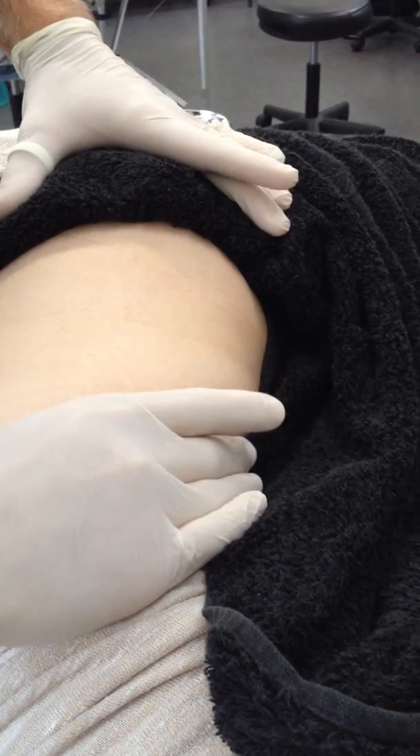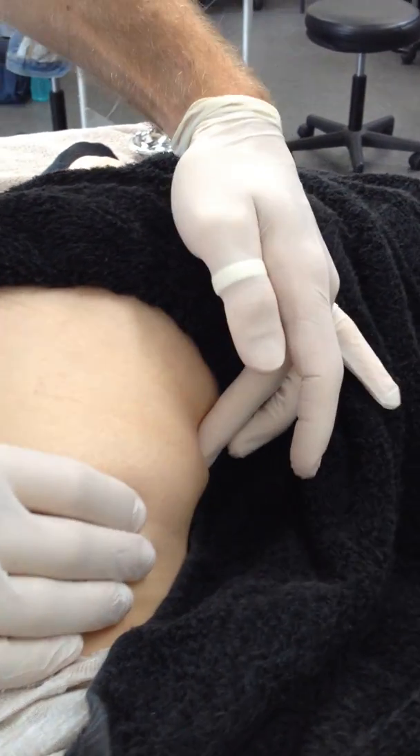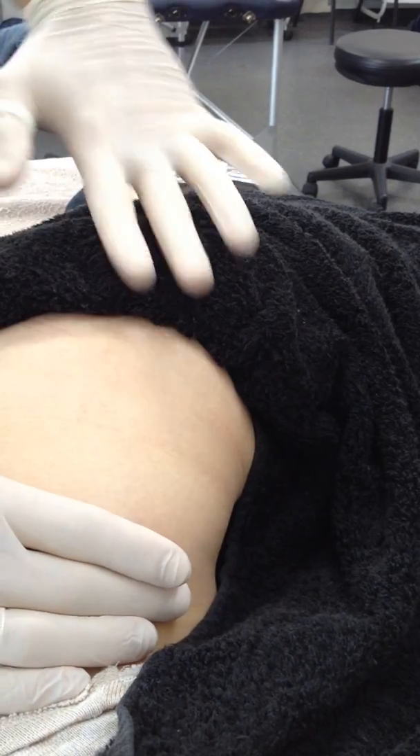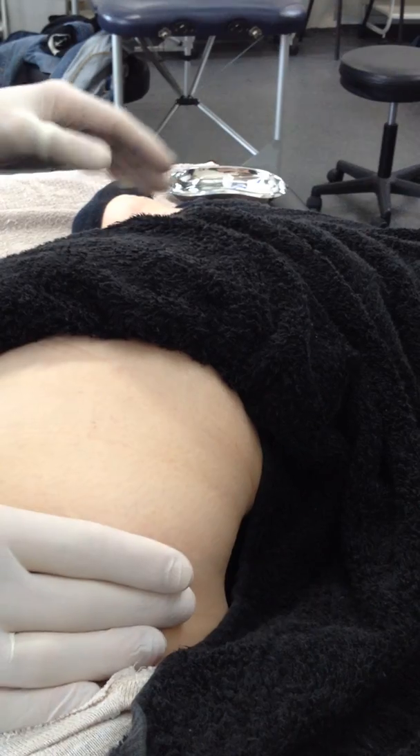We're going to do TFL now, which comes off the ilium posterior to the ASIS. You find the ASIS back here and then it blends down into the iliotibial band, sort of over that greater trochanteric region.